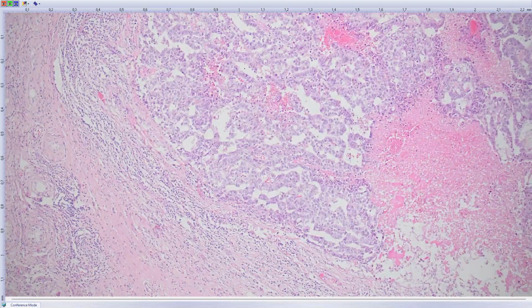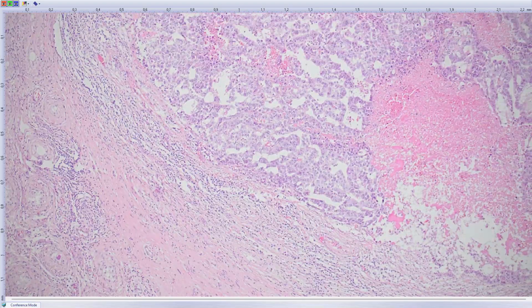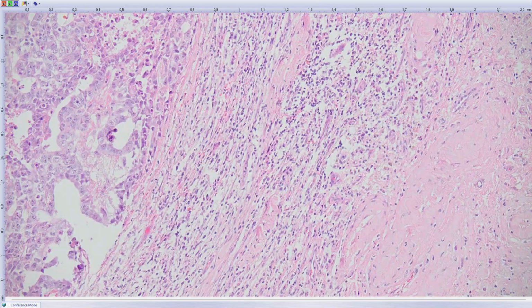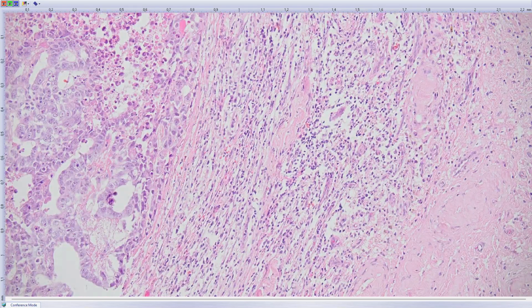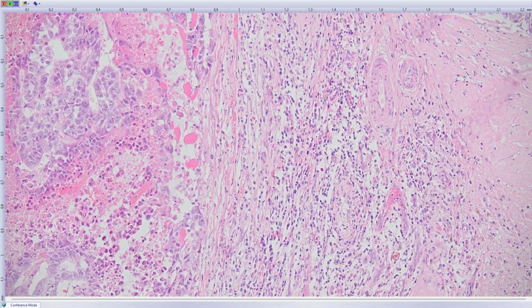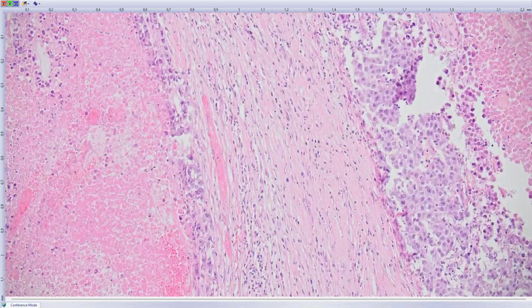Now you see maybe the deposits, it's parietal differentiation. Maybe here. I was not sure about that. So it doesn't matter. It's mixed germ cell tumor. And it is still treated differently. Okay.